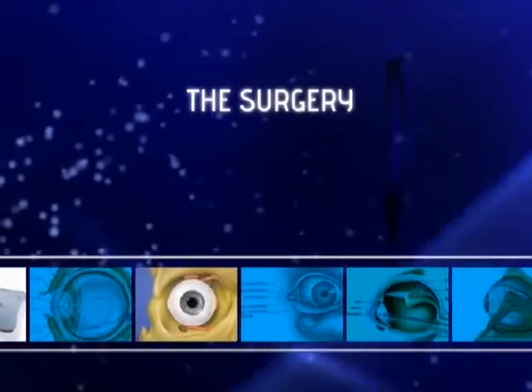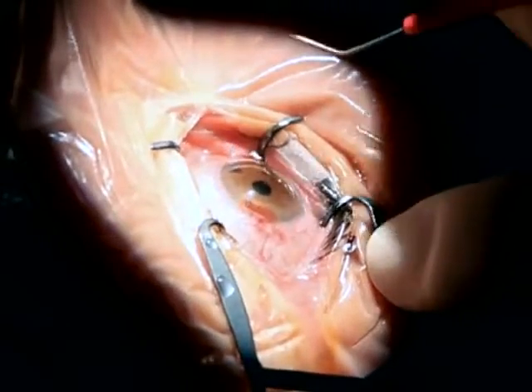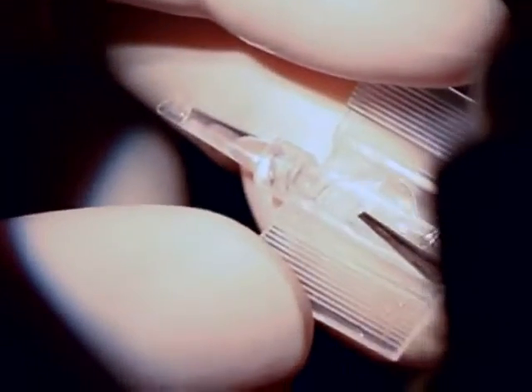How is this lens implanted? Two millimeter incisions are enough for the implantation, following the principles of minimally invasive cataract surgery. The lens has to be grasped in an appropriate position and taken to the cartridge of the injector with the tiny dot protrusion facing anteriorly.